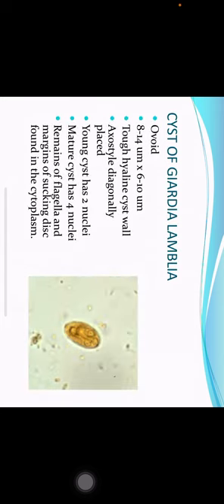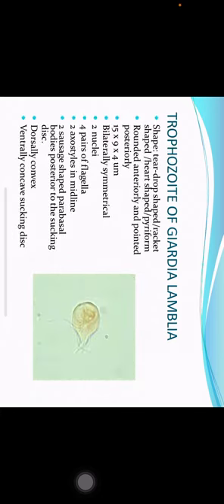Cyst of Giardia lamblia: ovoid in shape, 8 by 14 micrometers to 6 by 10 micrometers in dimension. A tough hyaline cyst wall is present. They have an axostyle which is diagonally placed. Young cysts have two nuclei while mature cysts have four nuclei. Remains of flagella and margins of the sucking disc are found in the cytoplasm.